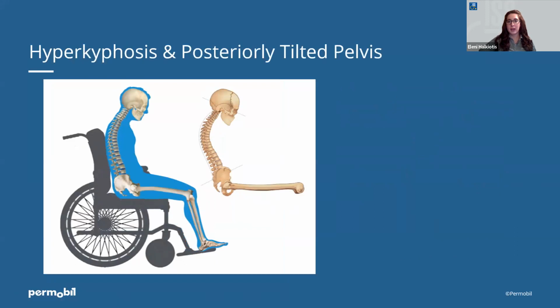person. But when a client is positioning themselves with a posterior pelvic posture, posterior pelvic tilt, we see the PSIS lower than the ASIS, and now they are also weight bearing on their coccyx and their sacrum, in addition to the ischial tuberosities.